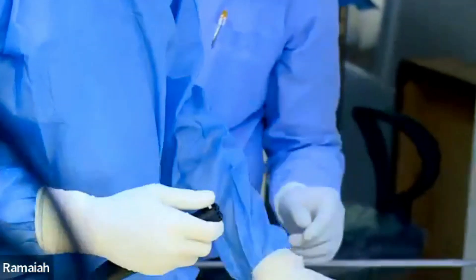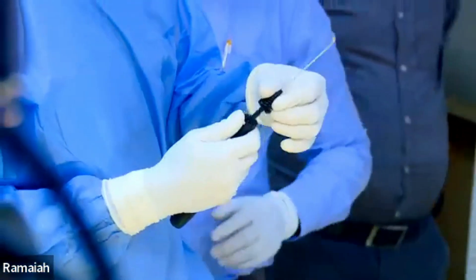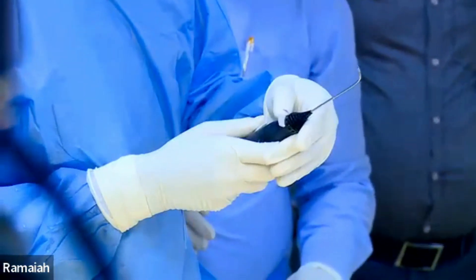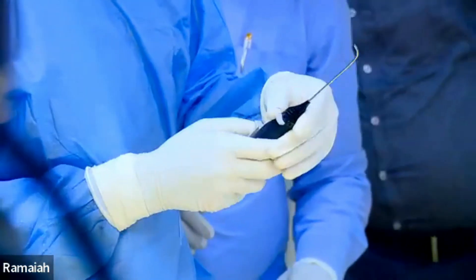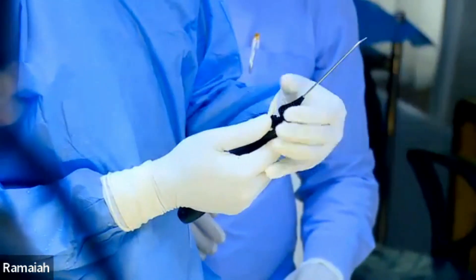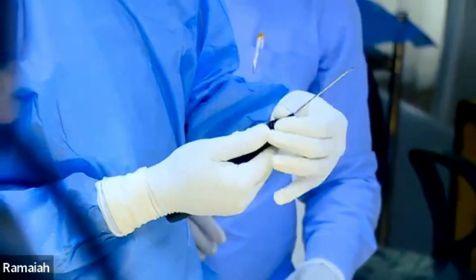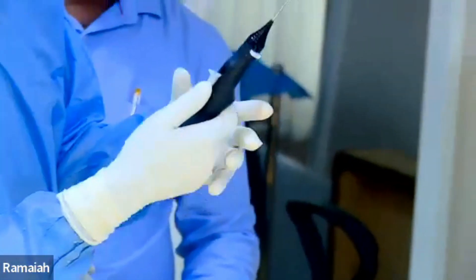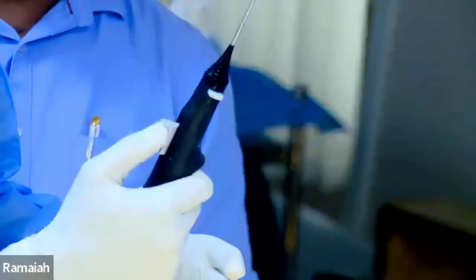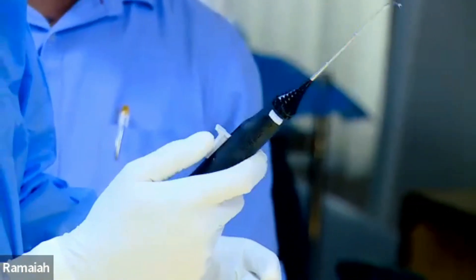There is one more which has a very high angulation — this is especially for the anterior horn. Anterior horn of either the lateral meniscus or the medial meniscus, you can use that. This one can also be turned 360 degrees as you like and fixed.